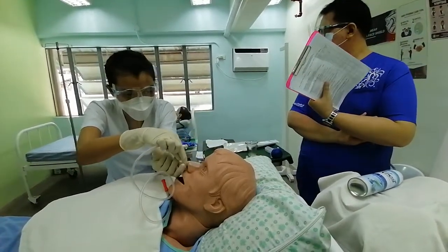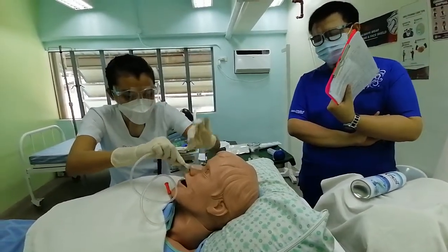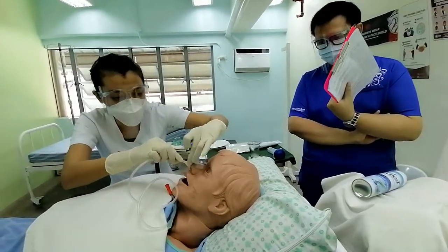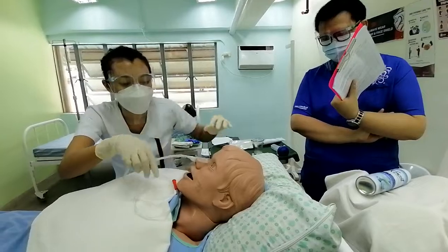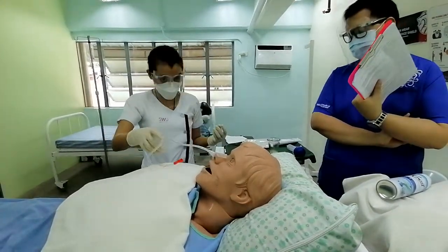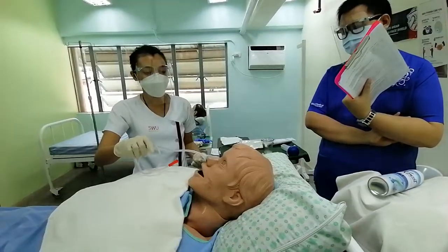And then, after securing the tape, the purpose of this is that the tube will not dislodge or displace, thus preventing irritation and trauma. And then I will now check for the proper placement of the tube.